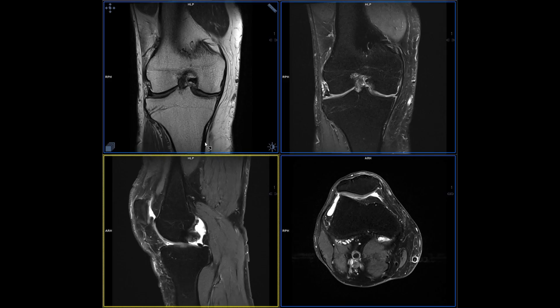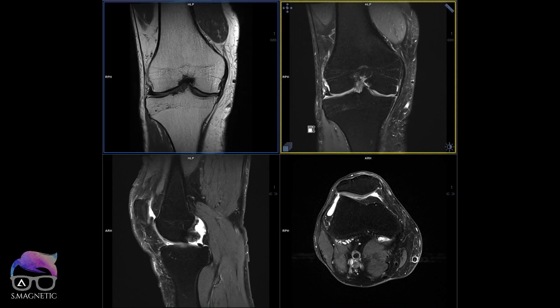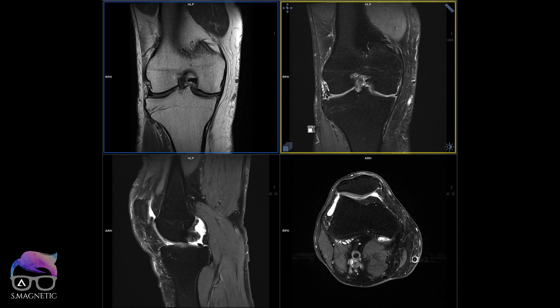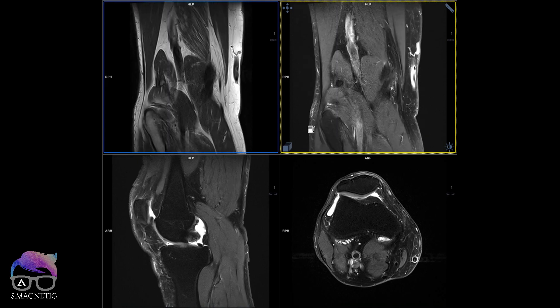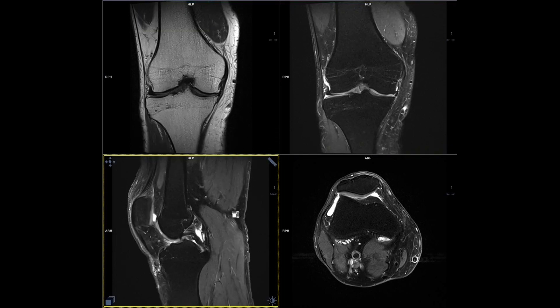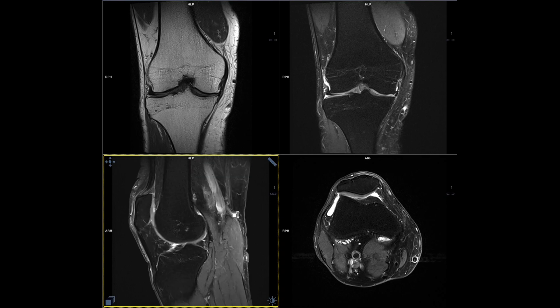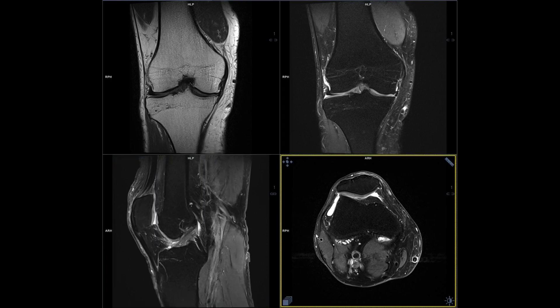Let's check the 2D results. You have a coronal without fat sat PD, coronal with fat sat, sagittal with fat sat, and then transversal with fat sat. Let's scroll through the coronal images — see this meniscus right there. The image is not that bad for being a short scan time. Then going through sagittal, you have the ACL right there. And let's check the transversal.